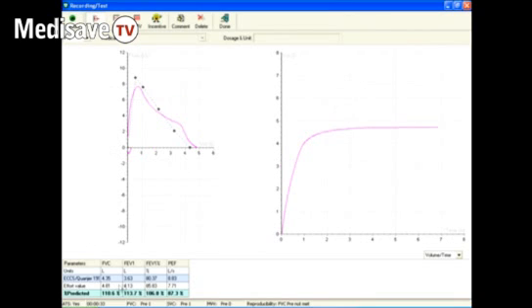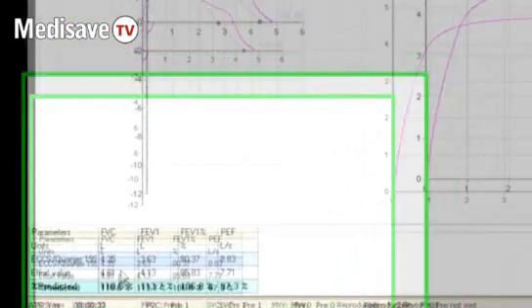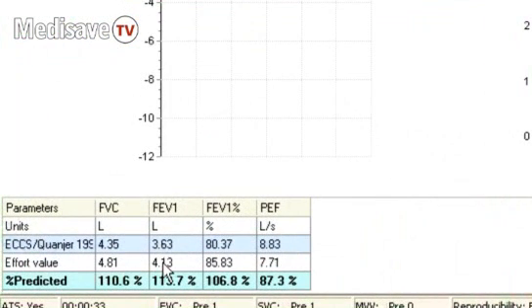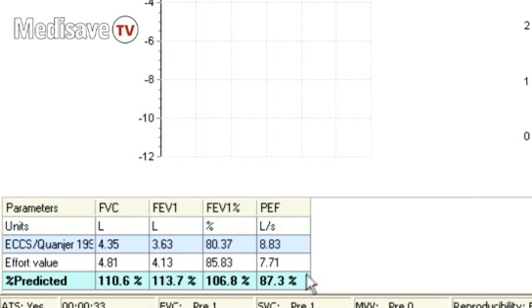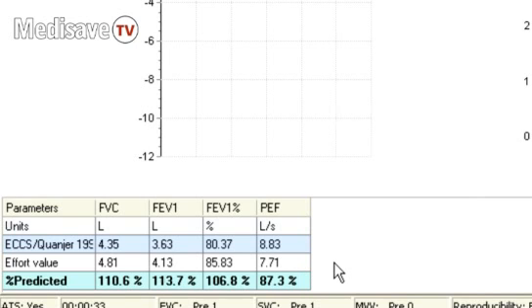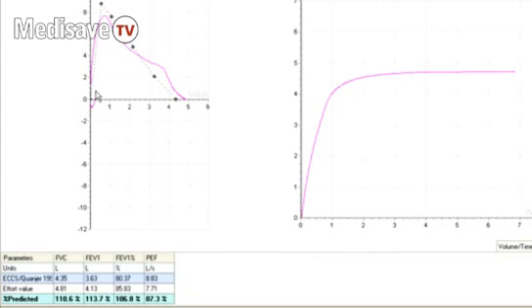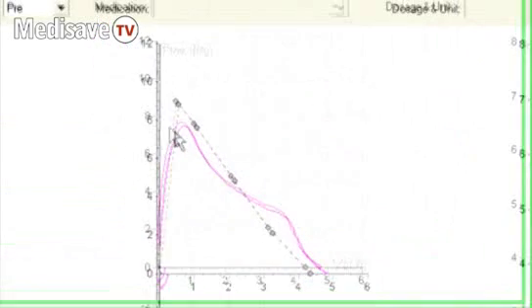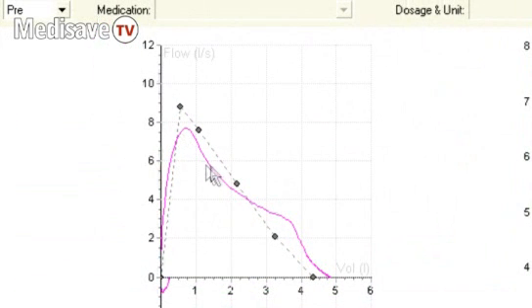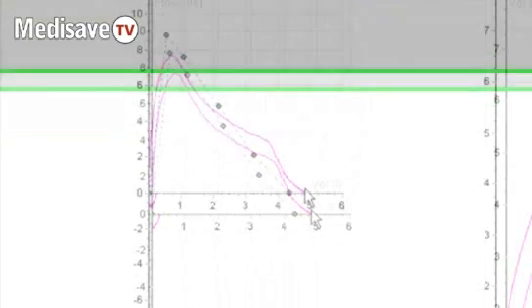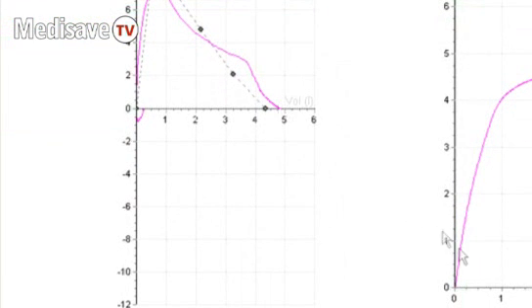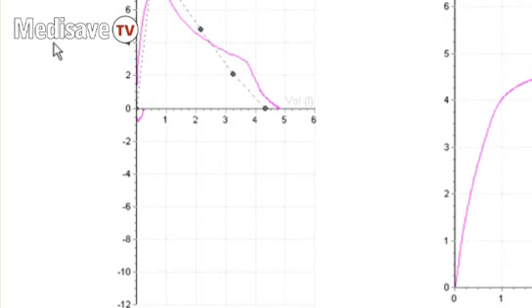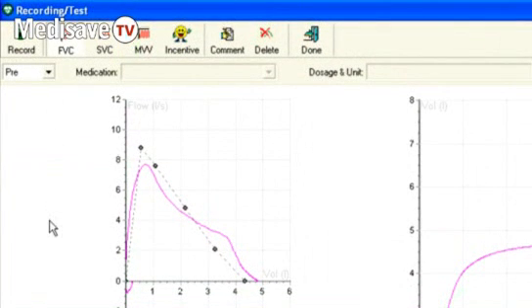You get a comparison of the blow they actually performed against a predicted blow based on their age, weight, and height. The blow that they gave is superimposed on the dotted line curve, as you can see on the screen. Now ideally you should do three blows, three FVC blows for a patient. So you go back up to the top and repeat this.